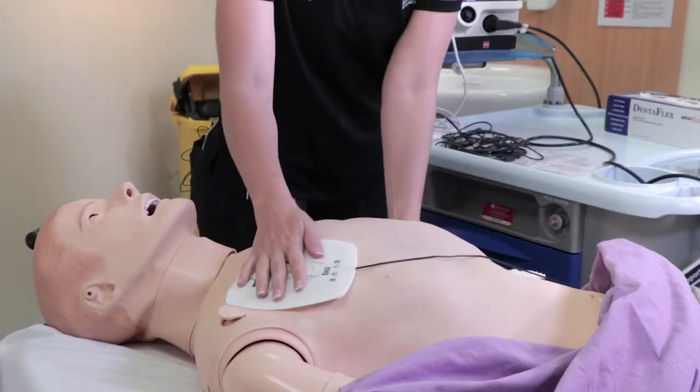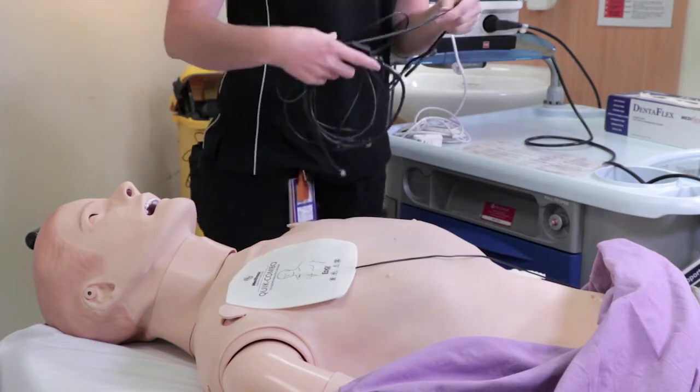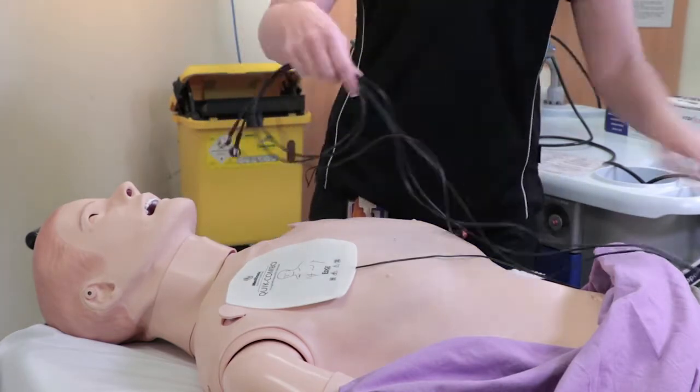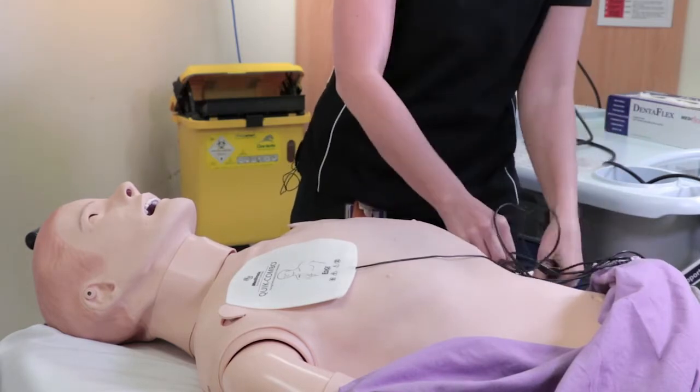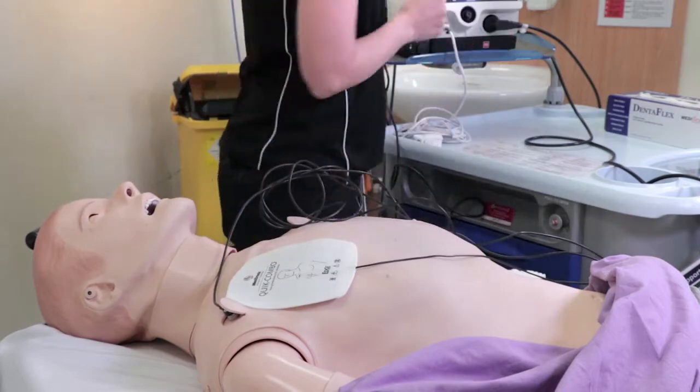Once the decision has been made to pace, you will need to correctly position the defibrillation pads on your patient as well as the monitoring leads. The pads will initiate pacing and the leads detect the patient's intrinsic rhythm.